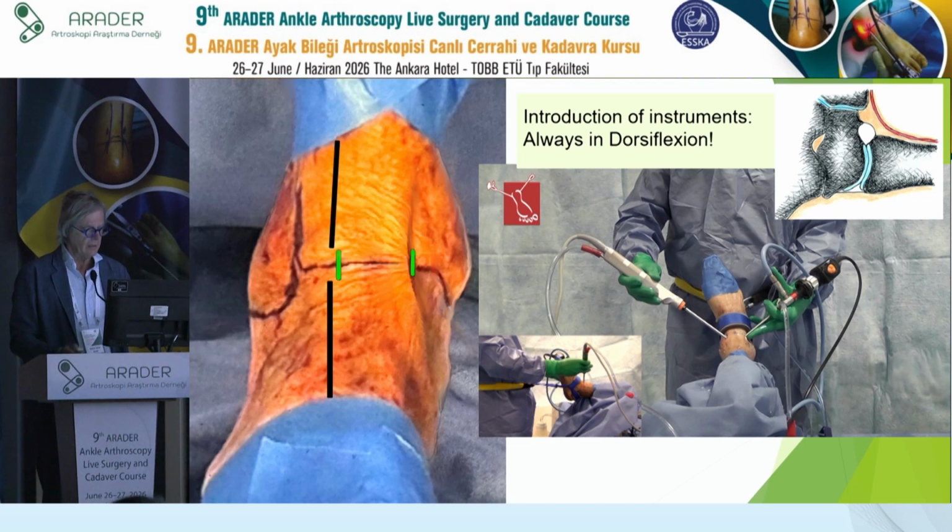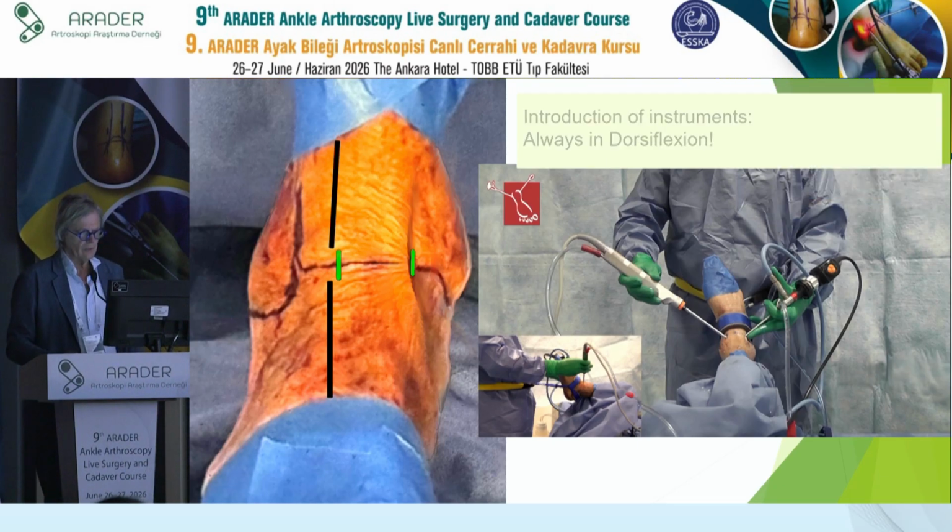So the introduction, the subcutaneous tissue doesn't move, or normally moves in relation to the skin incision when you plantar flex, so you cannot enter. So introduce in dorsiflexion.